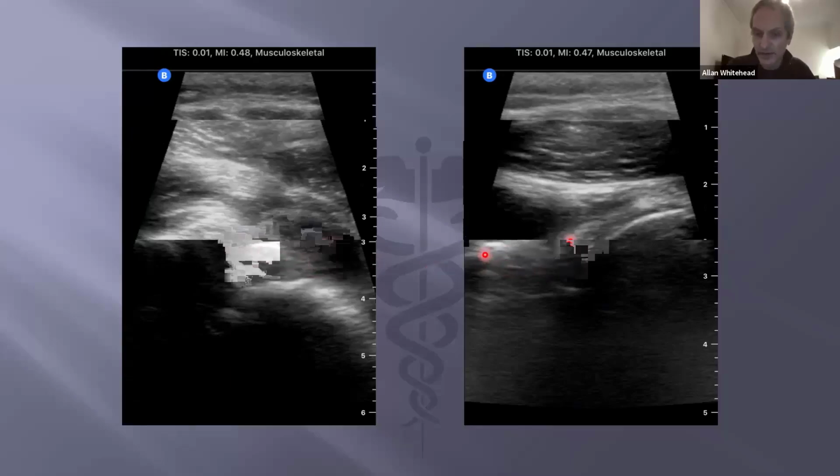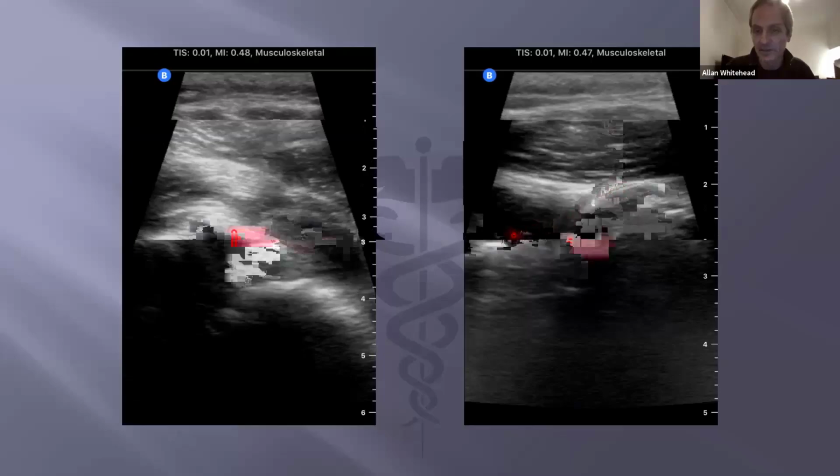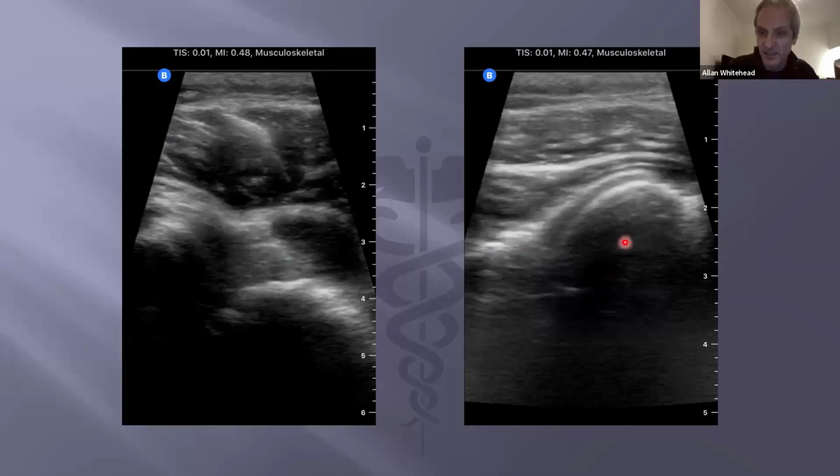And then post reduction, a bit clearer, more clearly seeing the glenoid here, and then the head has risen up really nicely, from being dropped down by at least 1 centimeter to sitting actually closer to the probe now, a bit more posteriorly positioned compared to the glenoid, which is common, but not so much that it's more than 1 centimeter difference.